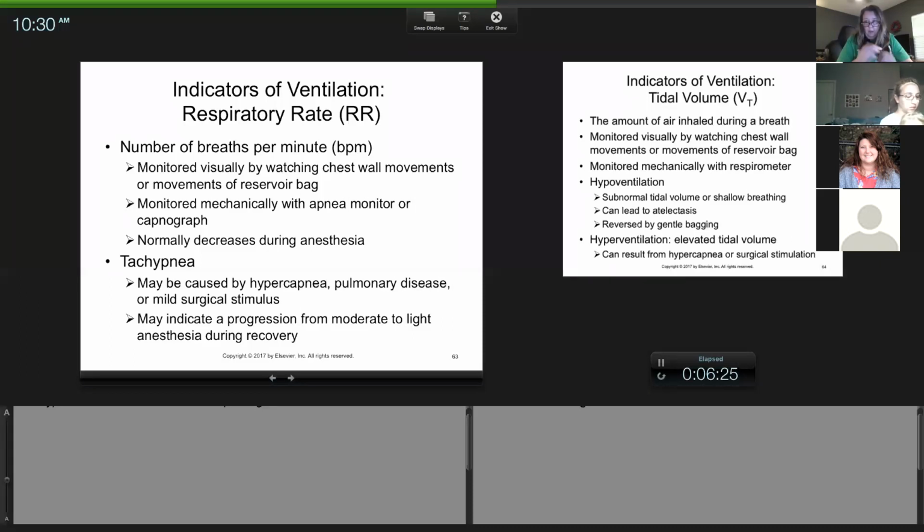Dogs that are on high, mmHg, Michaela, that should be 40 mmHg, millimeters of mercury. Thank you for mentioning that.